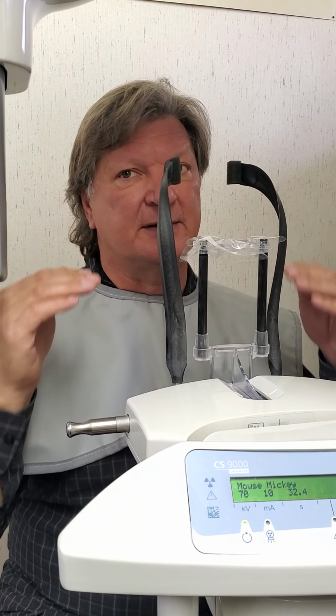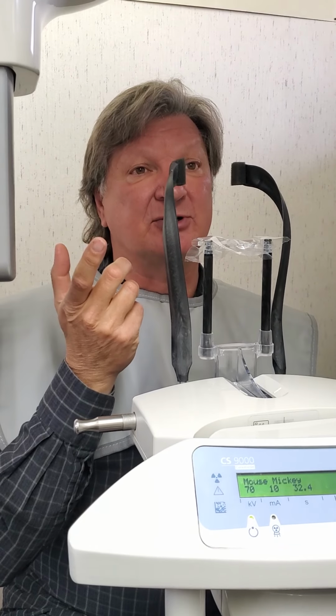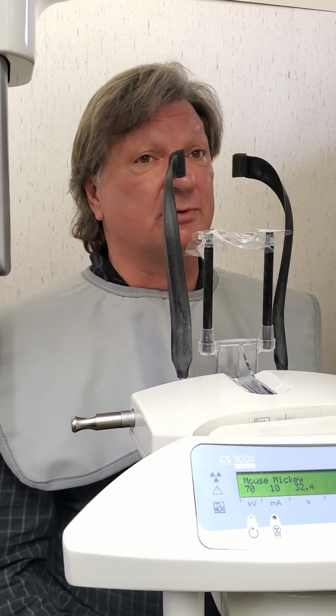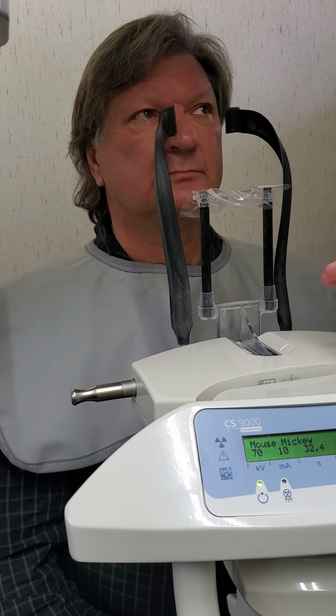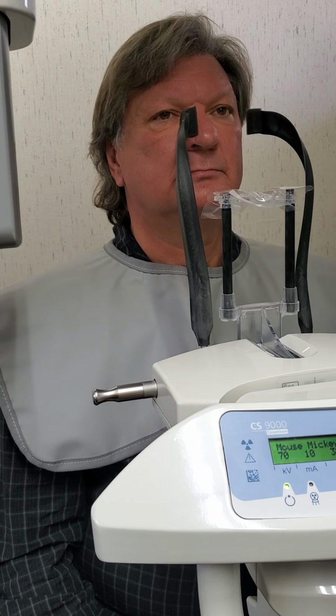All of the teeth. I.e., when they're making a surgical guide, if we don't have that, they can't make the surgical guide because the surgical guide is made to fit on the cusp tips of the teeth. Okay, so that's why we're trying to do that, and that's also why we leave it a little high, so that it shows root tips and entire crown.